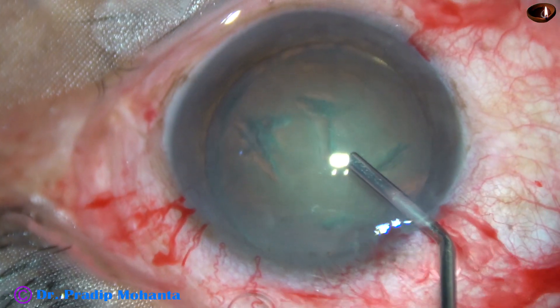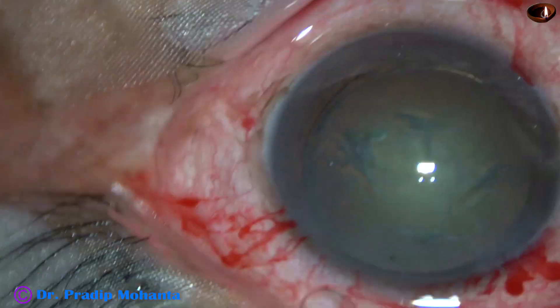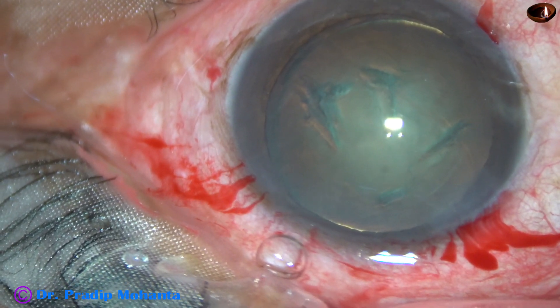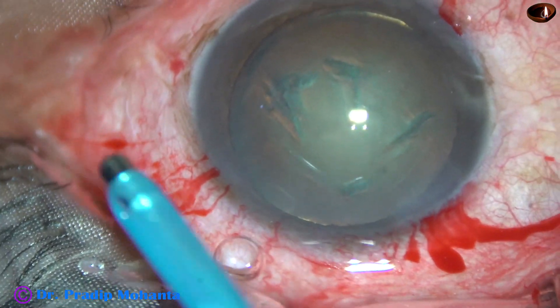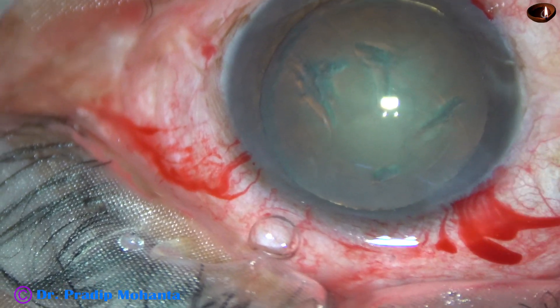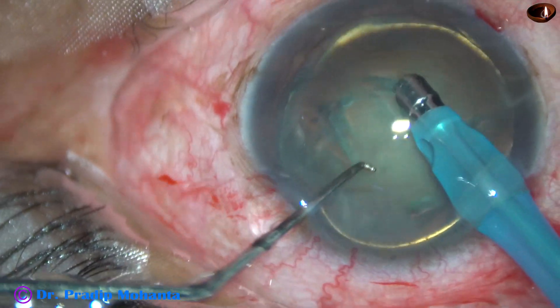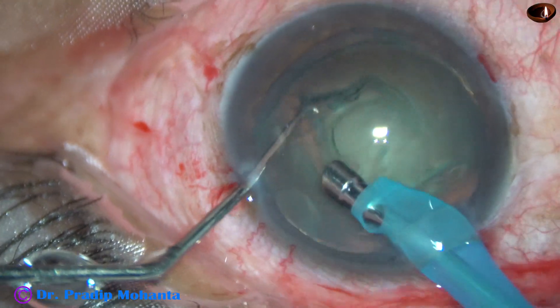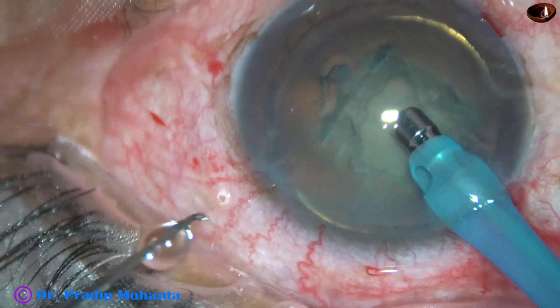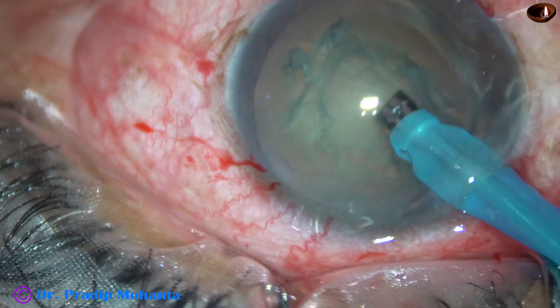Viscoelastic is again injected into the anterior chamber. Now is the time to introduce the tip of the phaco needle. The phaco needle goes into the eye with its bevel down, and some superficial cortical lens matter is removed. Then the handpiece is turned to make the bevel up.